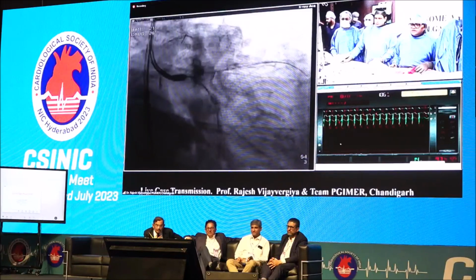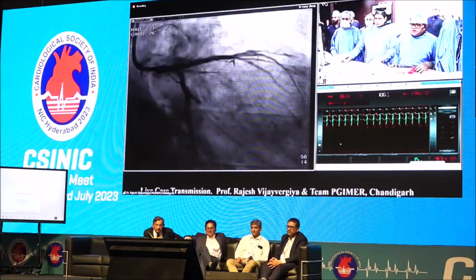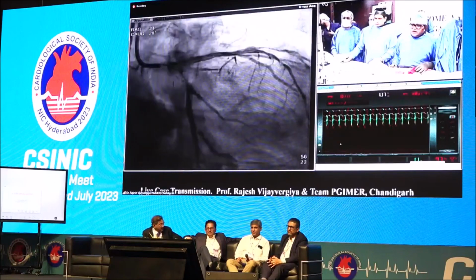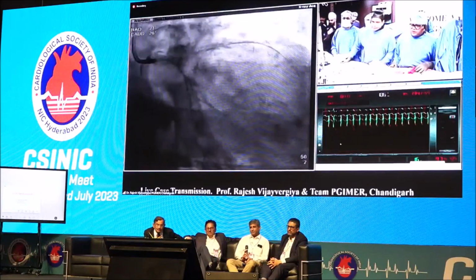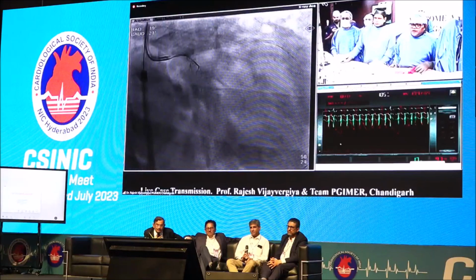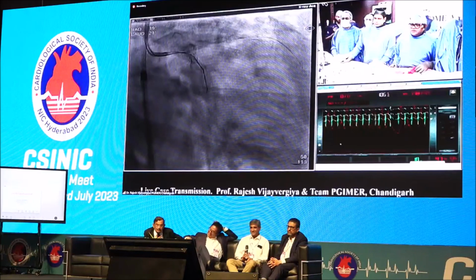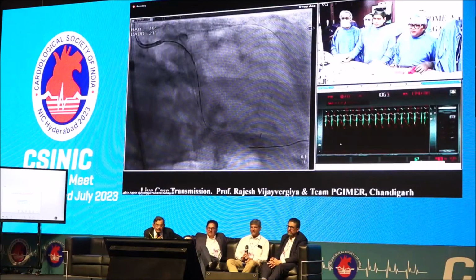Next. Next. And this is what is there after having a dilatation of left main to LAD with 3 distally, 3.5 proximally, and 4.5 in the left main as a POT. Next view. And then we rewired the left circumflex. Next, dilated with a 2.5 millimeter balloon.